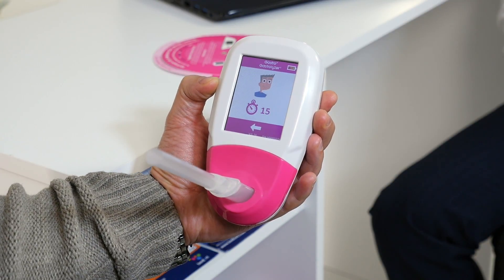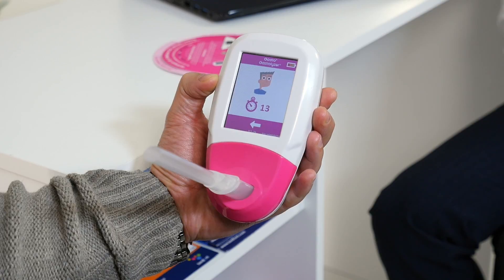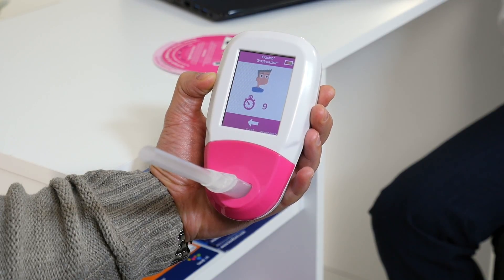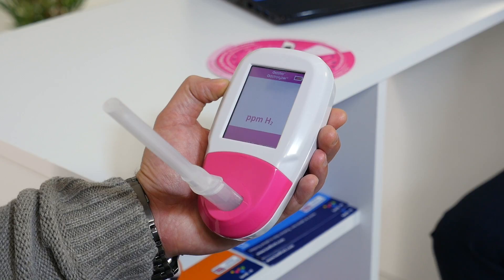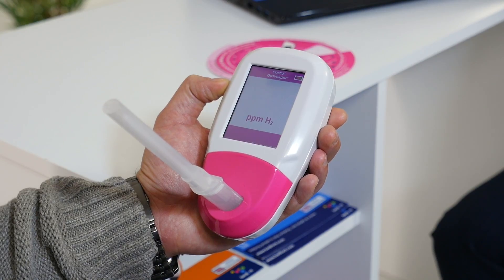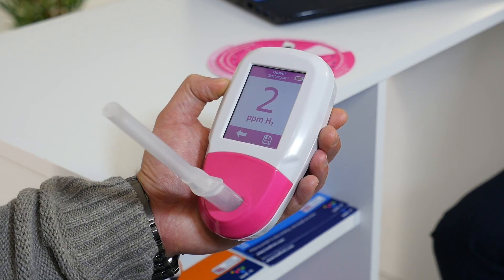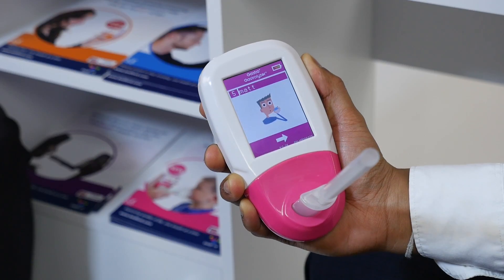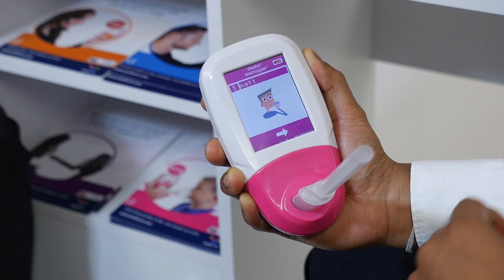If the egg timer displays, the sensor is zeroing. The patient will then be asked to inhale and hold their breath for 15 seconds before slowly exhaling into the GastroPlus. The PPM levels will rise and hold on screen. The option to save the test will appear on the bottom right. This will save the test to the patient's profile. The screen will then prompt the patient to drink a substrate.